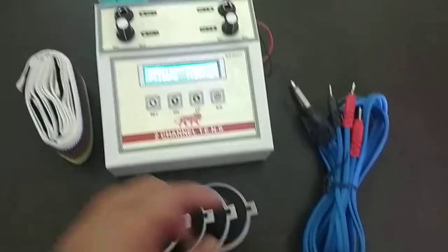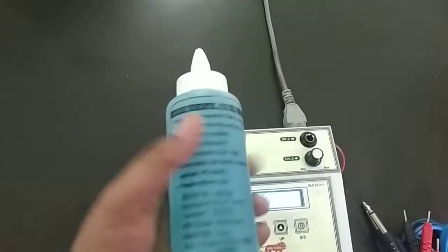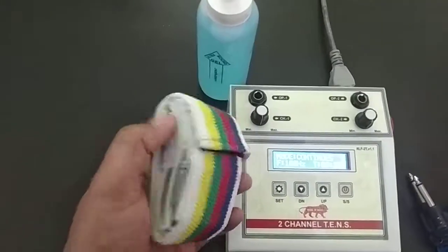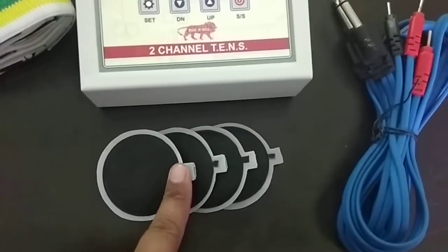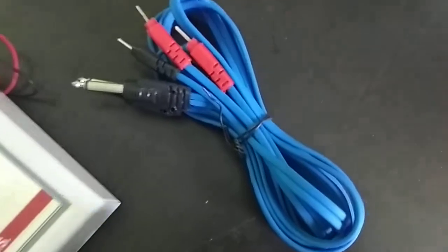These are screws. This is gel bottle. And this is belt. These are pads. And this is output wire.